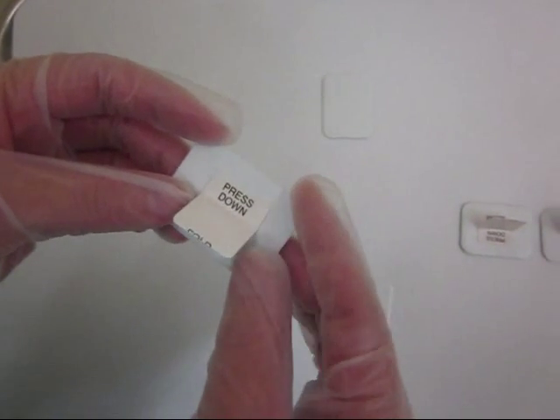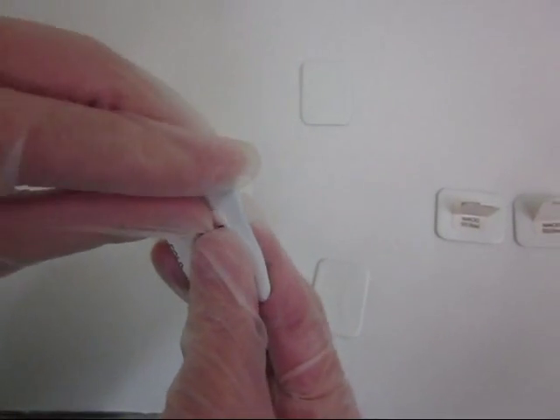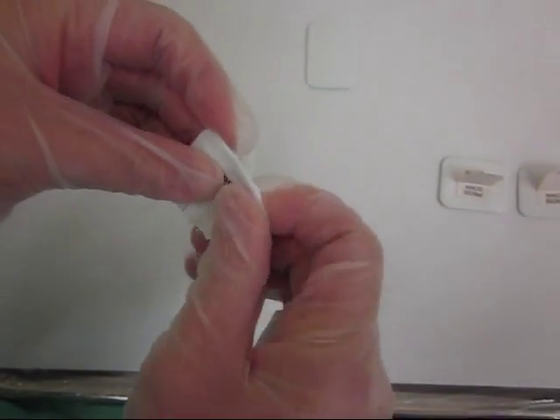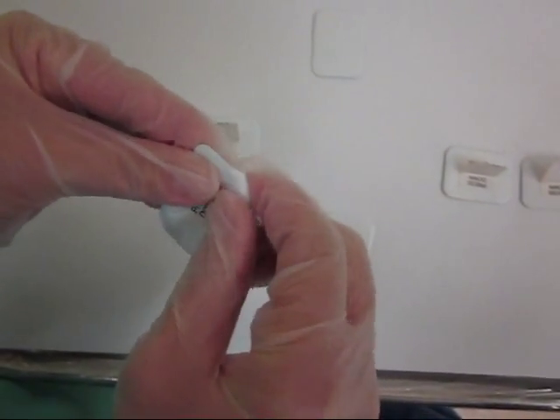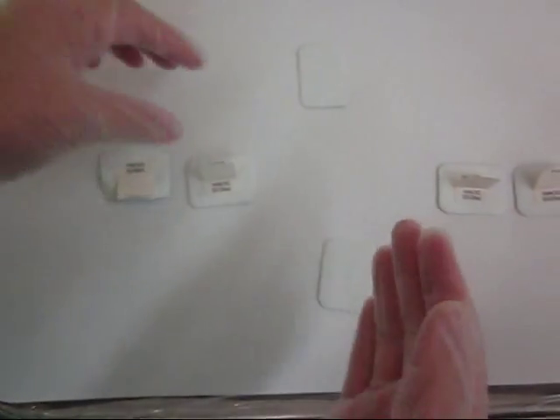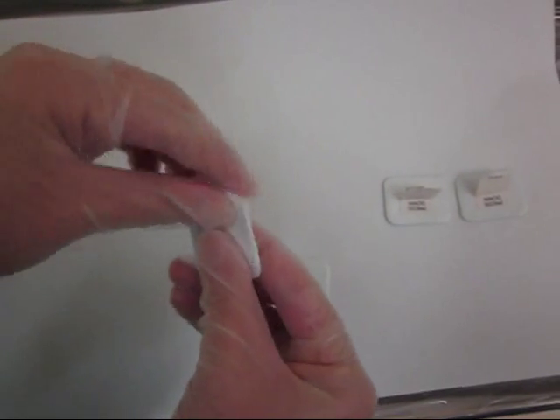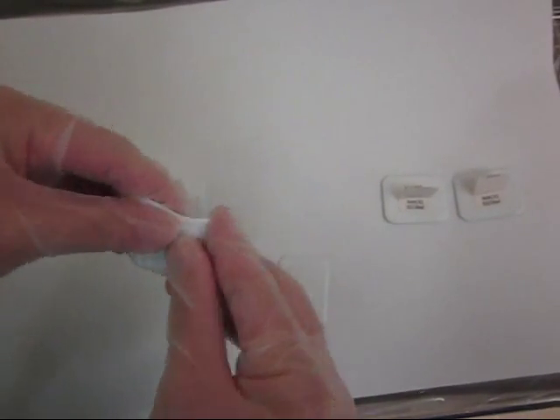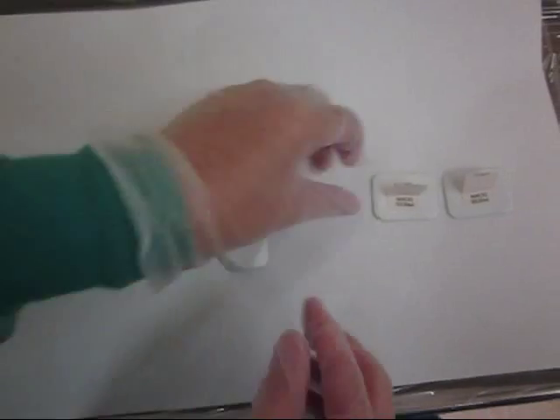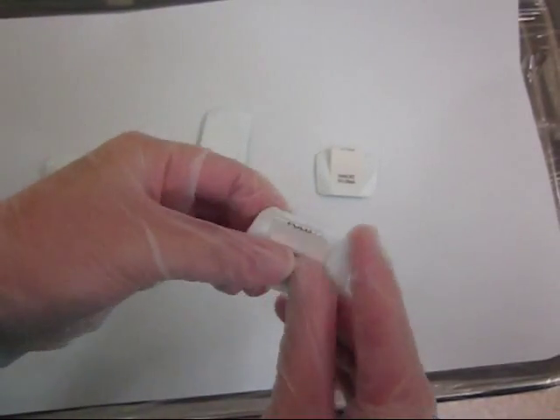Okay, so Mr. Dexter is uncomfortable, so let's make him comfortable. Let's do this. Bend the corners — the corners will make it definitely more comfortable so the corners don't poke his mouth. Good. Okay. Might as well do it for the rest of the film. Okay, bending, bending all of them. Mr. Dexter wants to be comfortable. Okay, this will definitely make him happier.